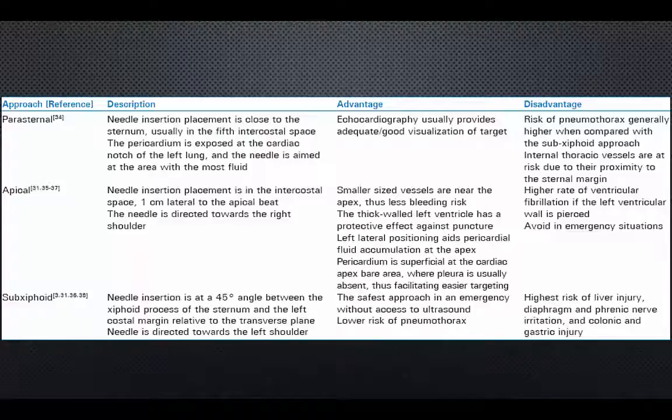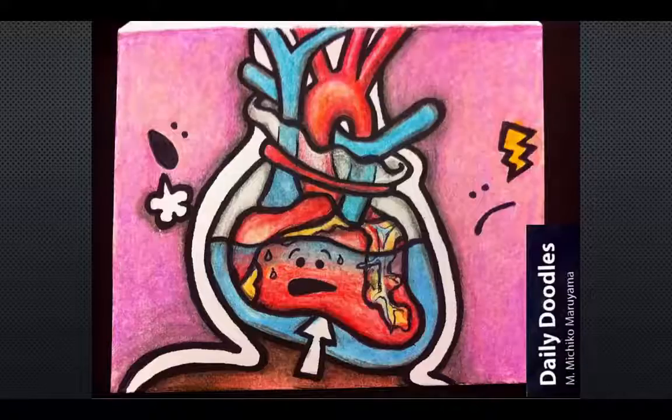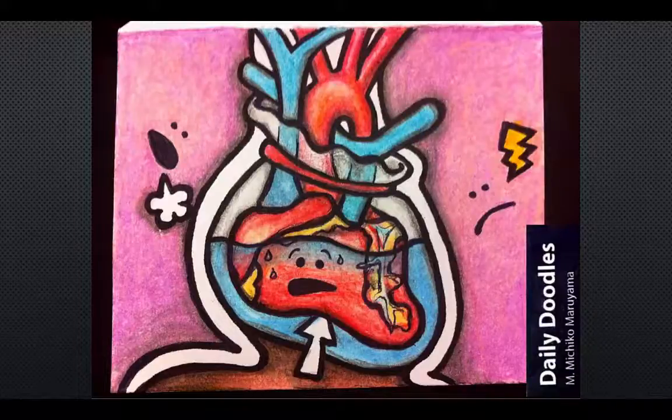In both approaches, make sure to avoid the neurovascular bundle on the underside of the rib, staying flat to your point of entry. Although most references cite a drainage of 60 milliliters of pericardial fluid is sufficient to improve patient status, an indwelling catheter can be placed using a Seldinger technique to allow the pericardium to continue to drain. Post-procedure, the ultrasound can also be used to confirm reduction in the effusion, a lack of right ventricular free wall collapse, and a normal IVC response to respiration.